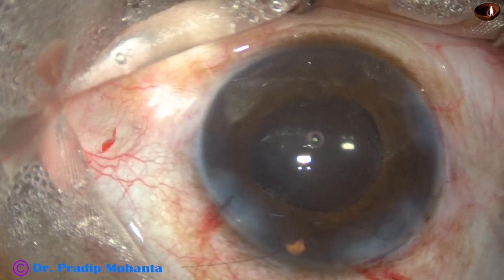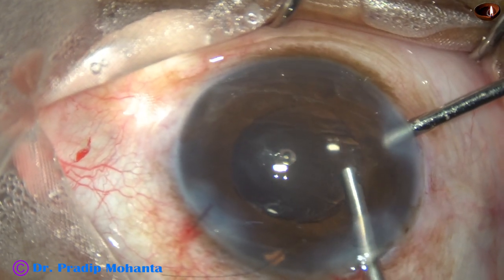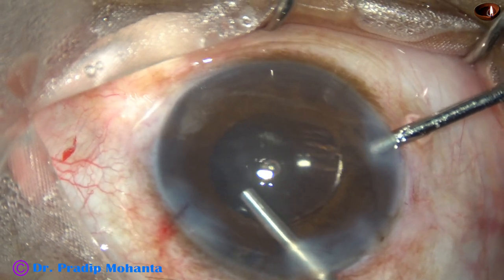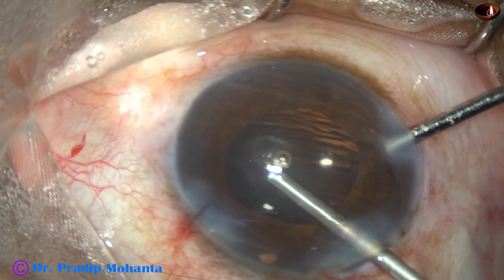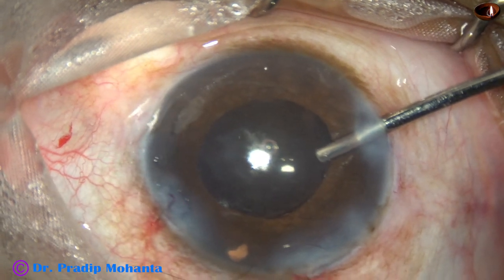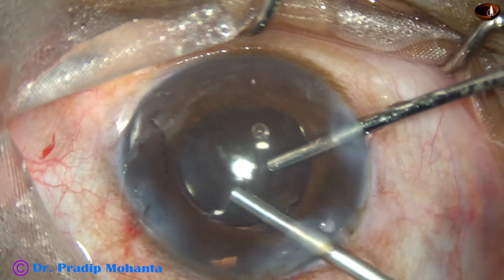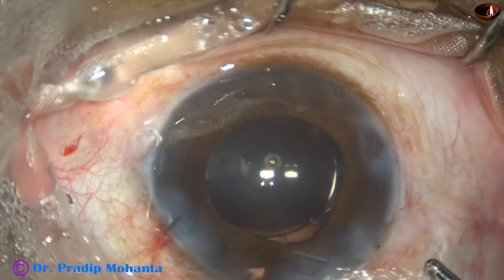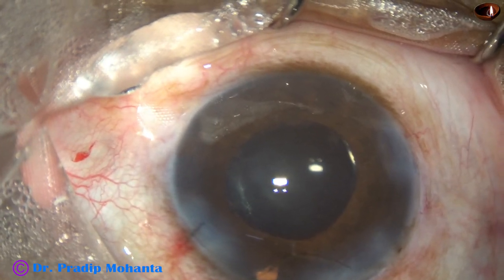I use irrigation through the 8 o'clock side port and the vitrectomy cutter through the main wound. One can do all these maneuvers through the side ports, but I take care of the anterior chamber depth — I lift off the internal wall of the main wound and maintain the depth of the anterior chamber. I suggest you can do all these through the side ports. The vitreous strands have been taken care of very nicely.